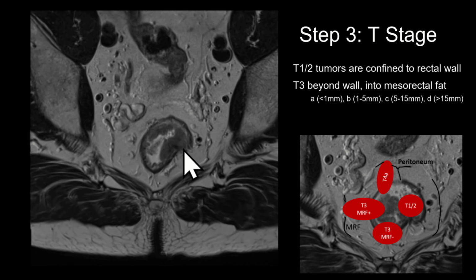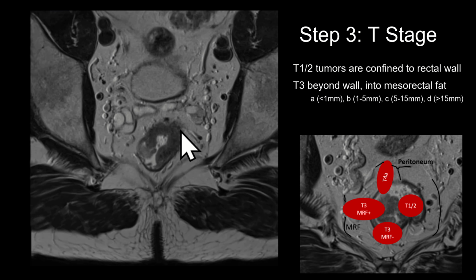So although differentiating T2 from early T3 disease can be challenging, that being said, depending on where you work, T2 and T3A tumors may be managed similarly and go directly to surgery regardless.